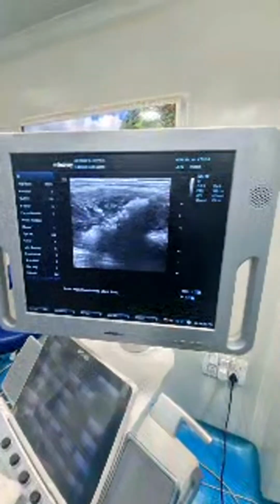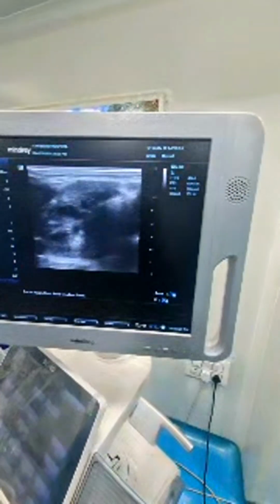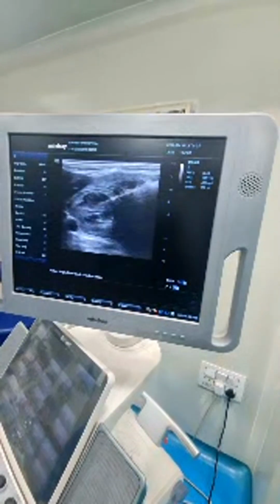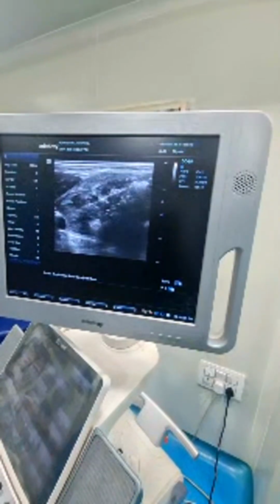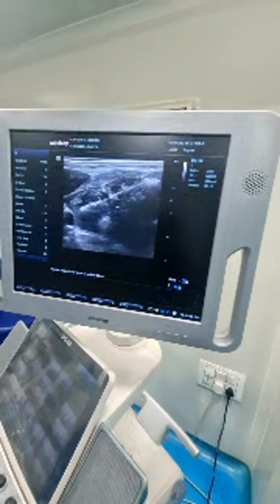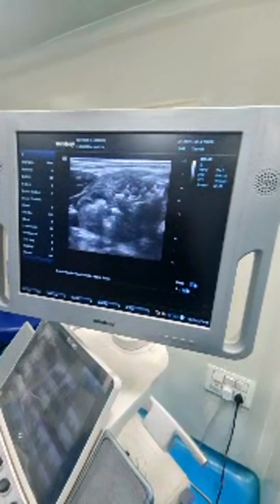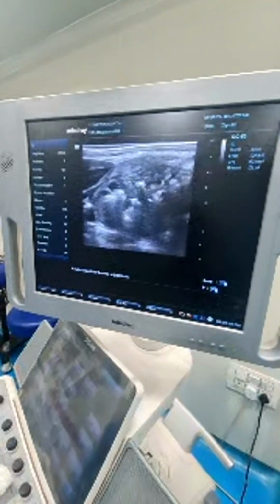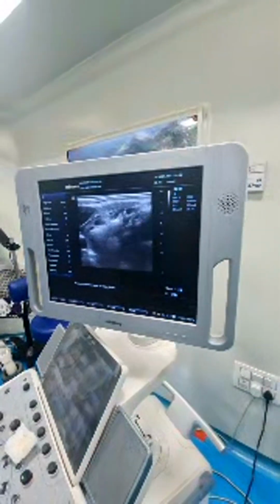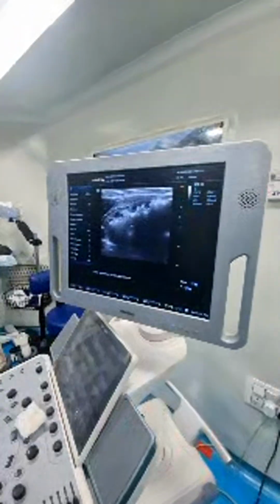This is called the moving shot technique. As we ablate, the probe keeps moving. Maybe a little dull pain sometimes. You can see the bubbles. It's called the moving shot technique. With every beep I am moving so that a new area is covered, so that the entire nodule is covered.